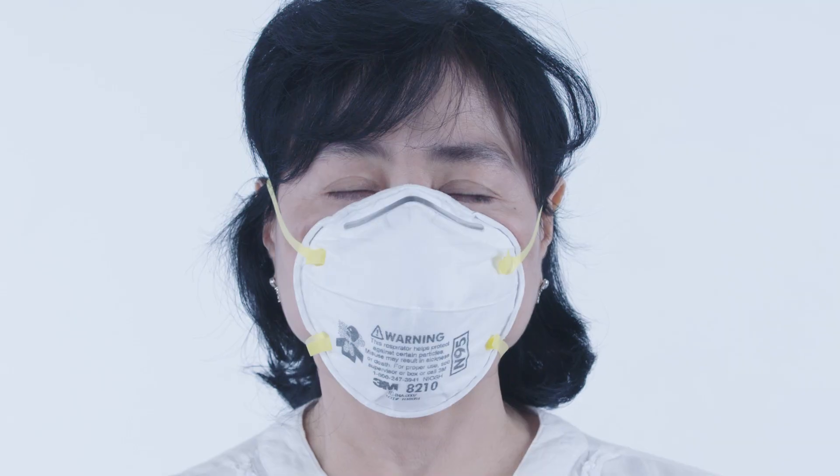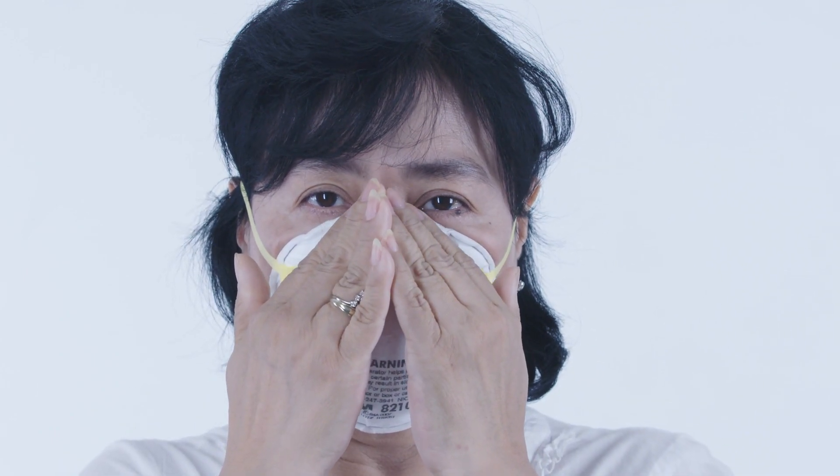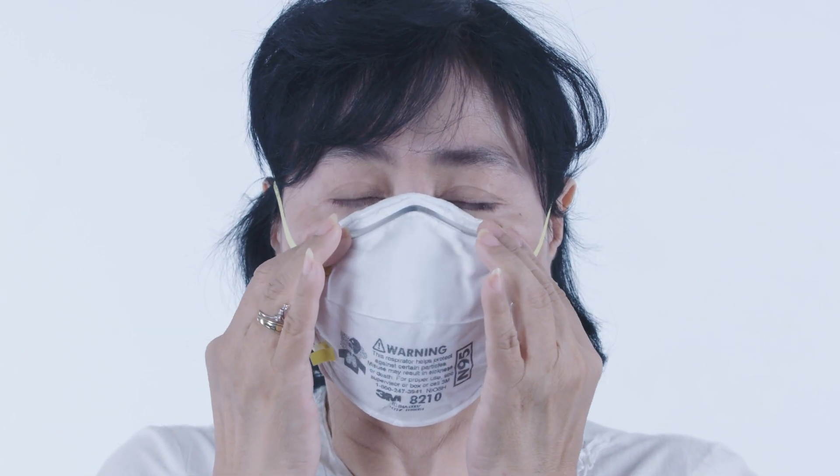Cover the mask with both hands, being careful not to change the fit. Breathe out sharply to check for air leakage around the mask edges, particularly at the nose. Make sure that glasses frames do not affect the seal between the mask and your face when you put them back on.